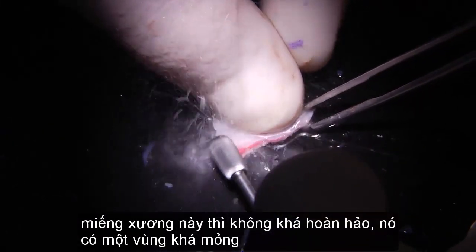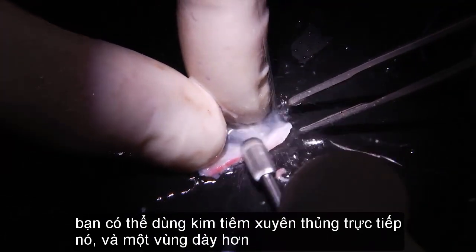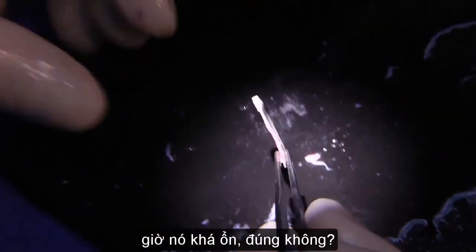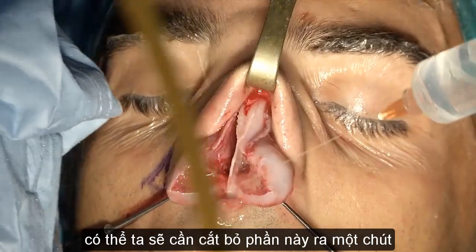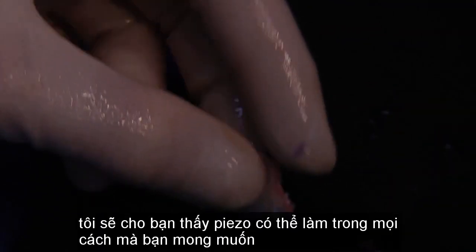Now this bone is not wonderful. It has a very thin portion. You can actually perforate with a needle directly, and a thicker portion. But I think it's worth it. Now frankly, this is also for demonstration purposes. I would do it in my case anyway. See, it's okay now, all right? It's better. Maybe we have to take this portion out, scissors. All right, burr. I'll show you the piezo. You can do it in any way you wish. No, maybe this is better for them.